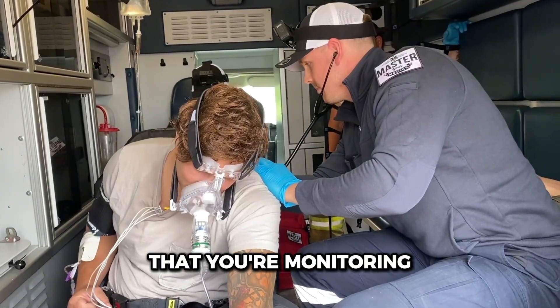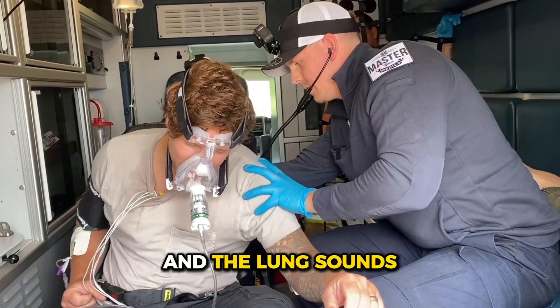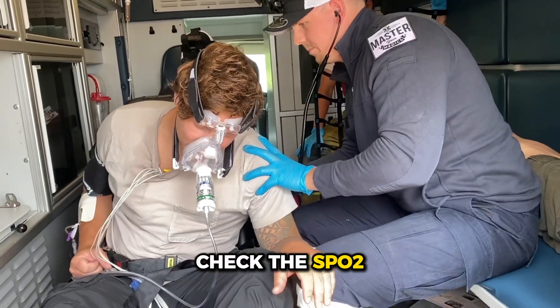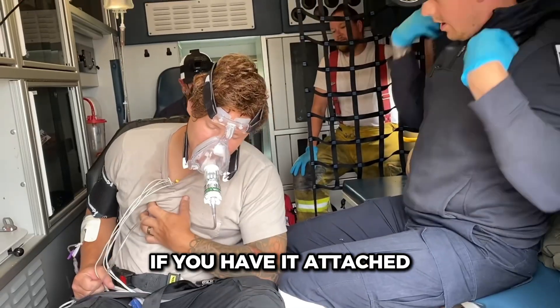So make sure that you're monitoring the respiratory rate, work of breathing, and lung sounds. Check the SpO2 and end tidal CO2 if you have it attached.